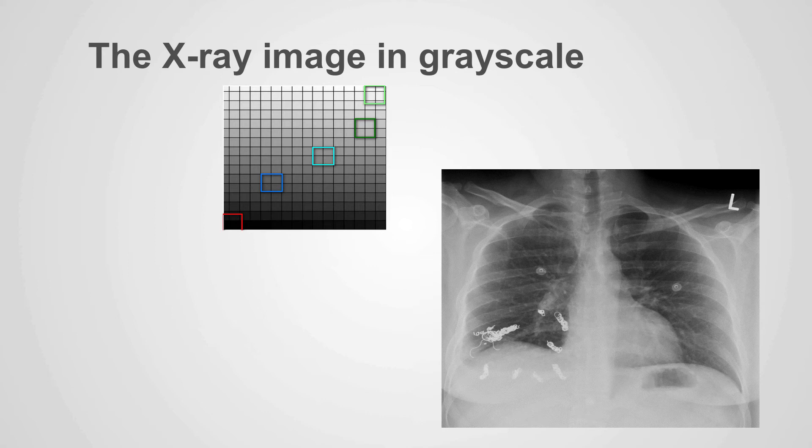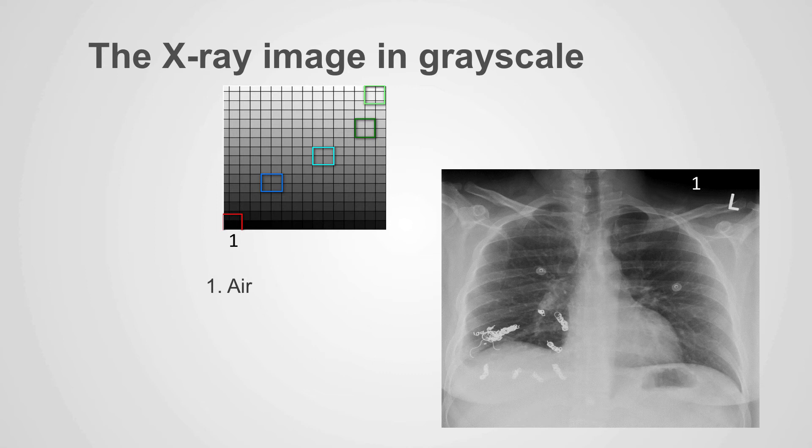On this image, we see the various possible densities that we encounter on an x-ray examination. Let's start by looking at the grayscale possibilities and we see that these range from very black to very white. On one end of the scale is air which is very black and we can identify on this x-ray very black area which is above the shoulders which represents air within the room above the patient. We also recognize that there's air within the lungs.